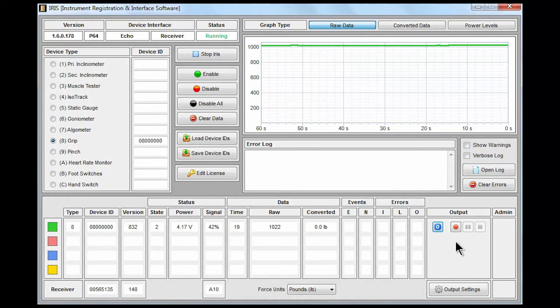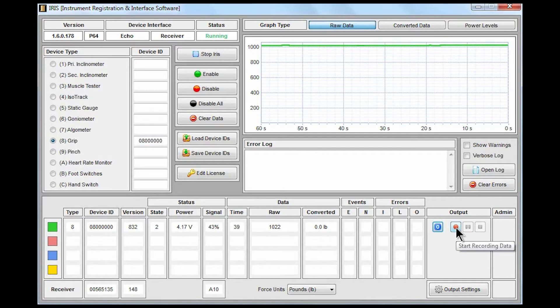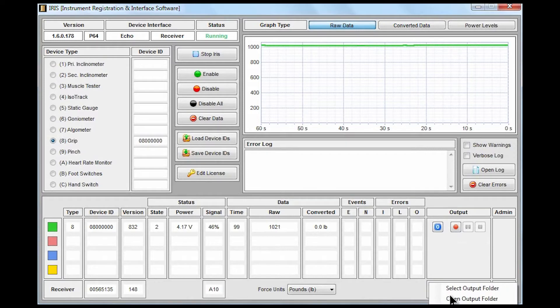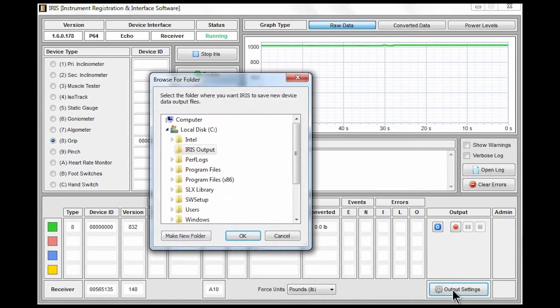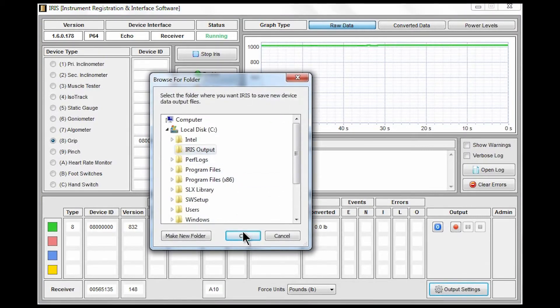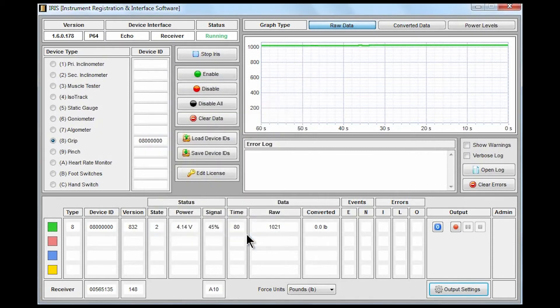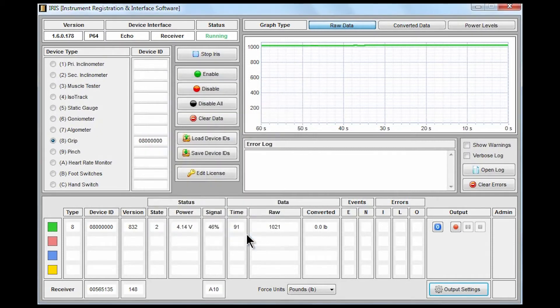To begin recording output from the device we have a small record button here we can click to start recording data. Before we do that though I'd like to just point out the output settings at the bottom. We can specify an output folder or we can choose to open that folder in Windows Explorer. Here I've already prepared an IRIS output folder right on my C drive, but you can choose any location that makes sense for you.